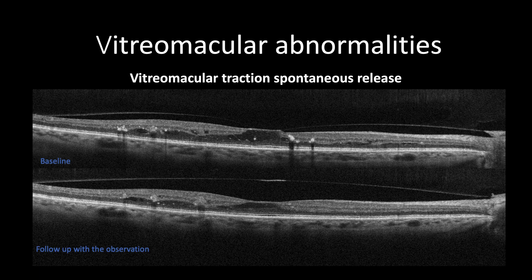This is a case of vitreomacular tractions with diabetic macular edema, presenting with 20/25 best corrected visual acuity, showing anterior-posterior oblique vitreomacular tractions with cystic formation and increased central macular thickness. The decision was to follow up the patient within six months, as spontaneous release of vitreomacular tractions occurred with improvement of best corrected visual acuity to 20/20 and reduced central macular thickness, with persistent macular cysts requiring no further intervention other than observation.